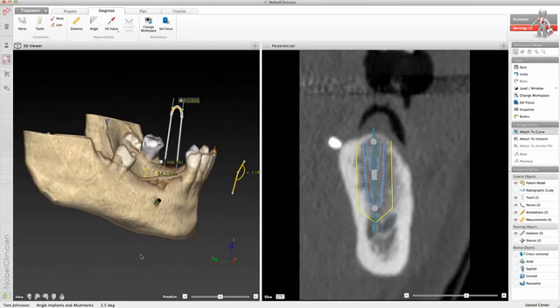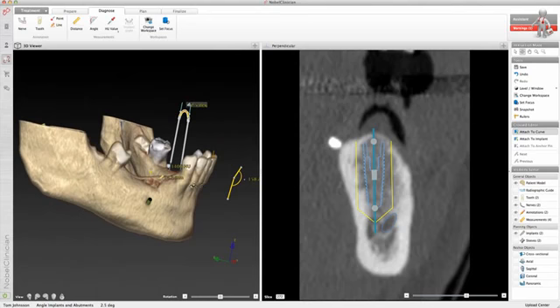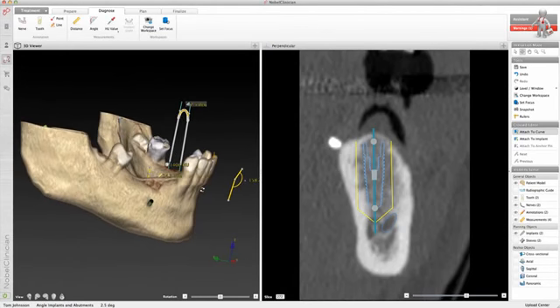If abutments have been planned for both implants, the 3D angle between the abutment axes is shown as well.